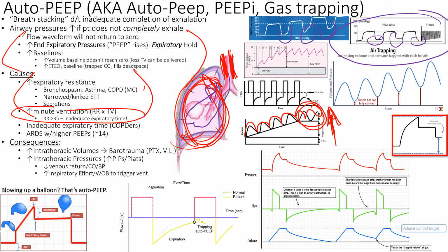So they inhale for 1 and they exhale for 3 seconds to keep those lower airways open at all times and provide that little positive air pressure, and that's what they like. So when they're used to that, they're going to start fighting the ventilator, and they're starting to get some ventilator desynchrony. Okay, so that's the problem that happens with a patient that has auto peeping. So that's the idea behind auto peep, right?